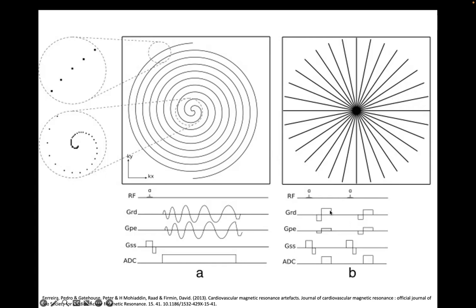And then stop. And then I will do that whole thing again, but I change these amplitudes such that now I'll move to this line here, and then the next one I'll move to this one here. The next one I'll move to this one. And so in that way, using a sequence of these pulses and gradient pulses, I can map out the Fourier transform of the object along these rays.